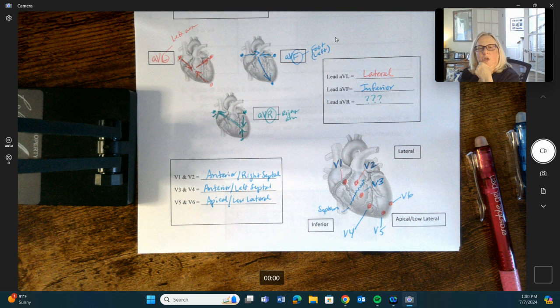All right, so you got your notes all filled in there. So this is how those leads that we learned, our lead direction, coincide with different areas of the heart. Now, why that's important from the cardiologist standpoint is when someone's having a heart attack, and we hook up the EKG machine and we can clearly see heart attack changes on the EKG, which is our next unit. And I see them in 2 and 3 and AVF, all the changes are in 2, 3, and AVF.